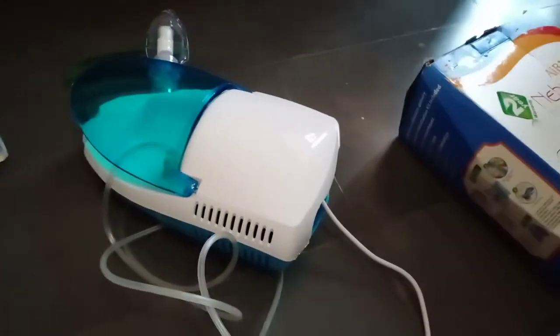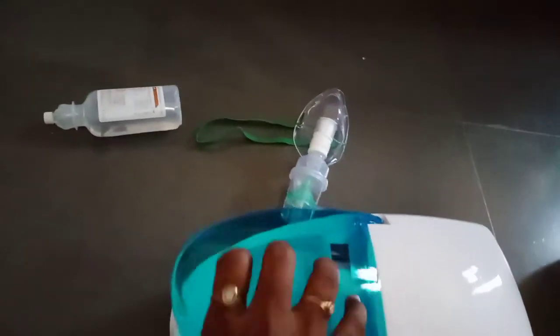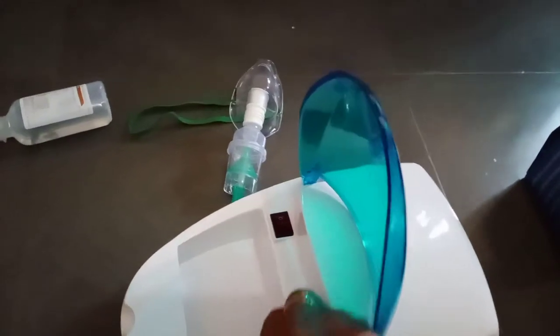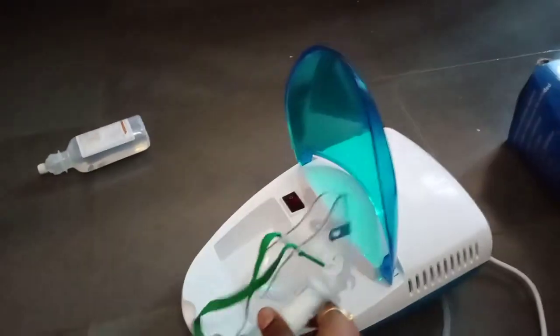We have 2 years warranty. We have the machine. We also have a mask — we can see it here.